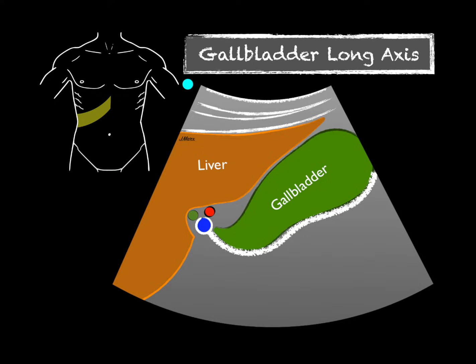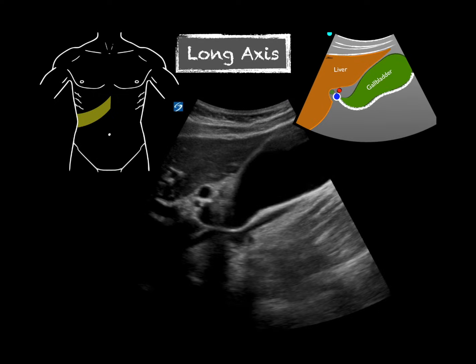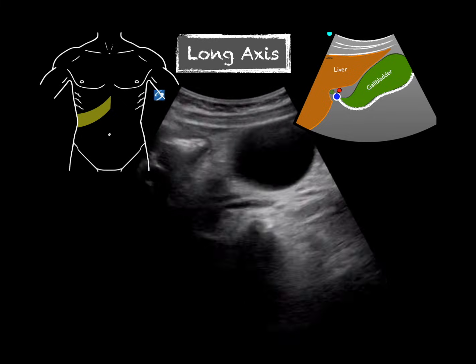Here's another example of how the gallbladder can lay. We can see over here on this side that the gallbladder is extending off of the screen. We ideally would like to see that in there. I imagine during this study that was imaged, and we would like to see that. However, we are able to see the gallbladder come down like this and come up here. Sometimes it can be hard to image it in a single image. We can use video if that's what you like to do. I like to use still images, but you can do video.